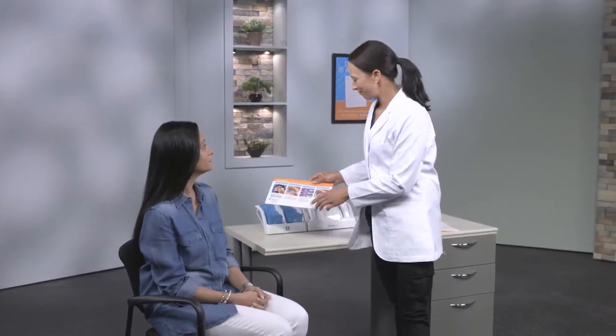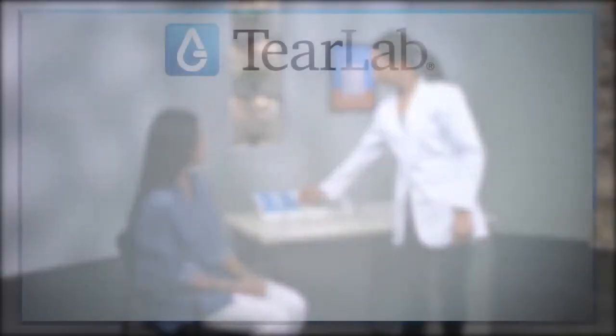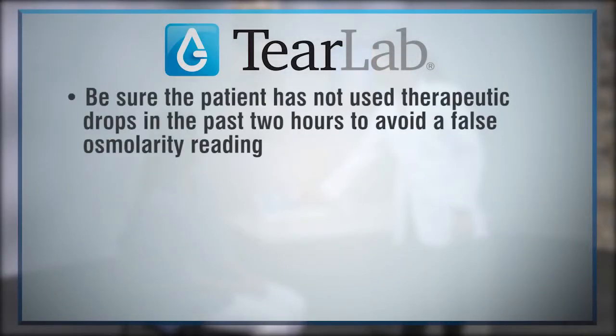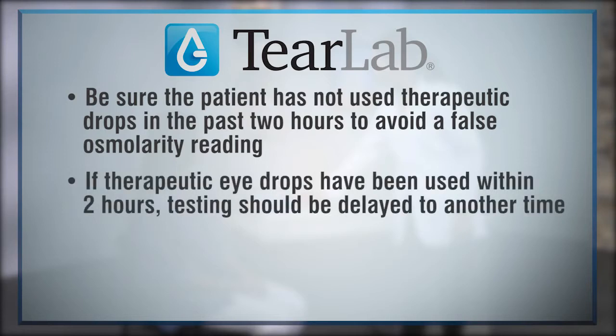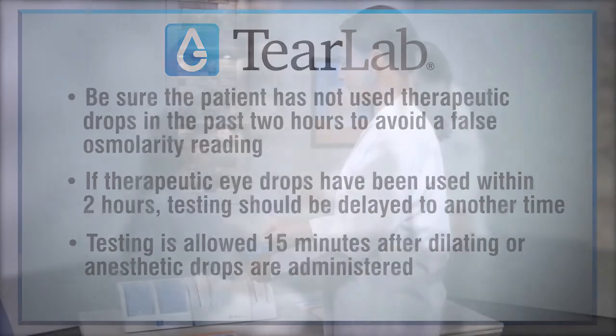After explaining the procedure to the patient, you are now ready for patient testing. Be sure the patient has not used therapeutic drops in the past 2 hours to avoid a false osmolarity reading. If therapeutic eye drops have been used within 2 hours, testing should be delayed to another time. Testing is allowed 15 minutes after dilating or anesthetic drops are administered.